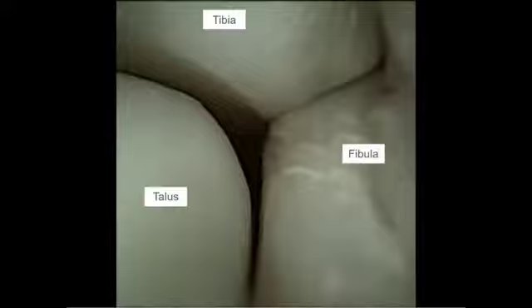Viewing from the anterolateral portal, we can see the lateral gutter with the tibia, fibula, and talus. Initial debridement is performed with a shaver to improve visualization. The distal accessory band of the AI-TFL is visualized next, which is then resected to improve visualization. It is critical not to resect too proximally, which could potentiate instability.